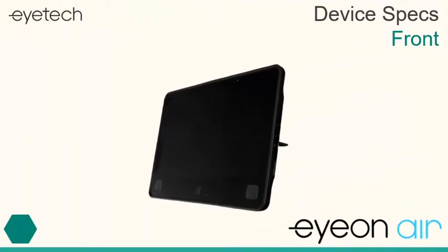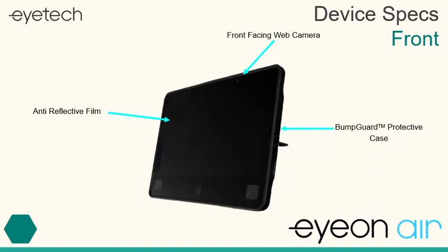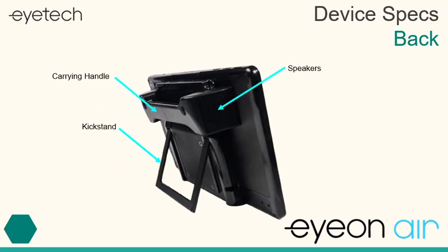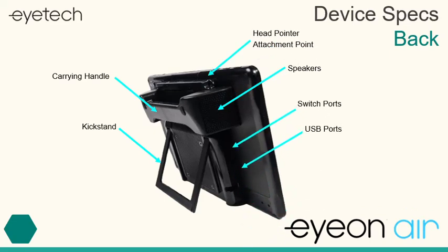On the front of the device, you'll find an anti-reflective film, a web camera, a protective case, and the eye tracker. On the back end, you'll find not only a convenient kickstand to prop up the device, but also a handle for ease of carrying, extra speakers for enhanced amplification, a head pointer attachment point, and both USB and switch ports.